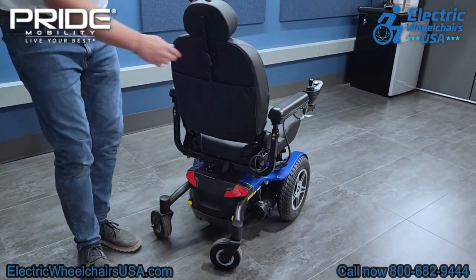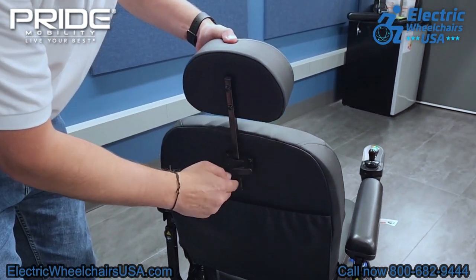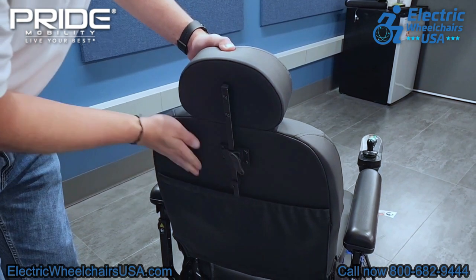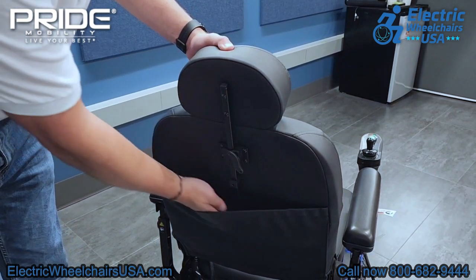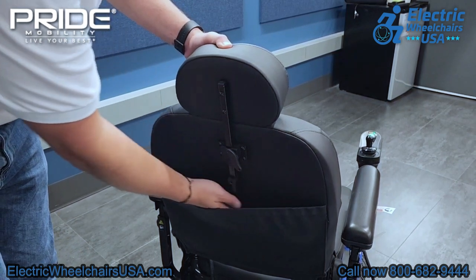The seat on this chair is very comfortable. The headrest is also height adjustable, which is a great feature if you're a taller person. There's also a storage pouch on the back of the seat, so you can put items in there such as your charger, which is a convenient and easy thing to do.